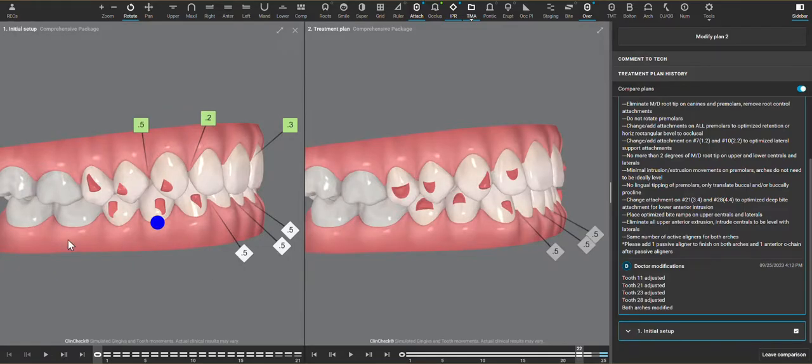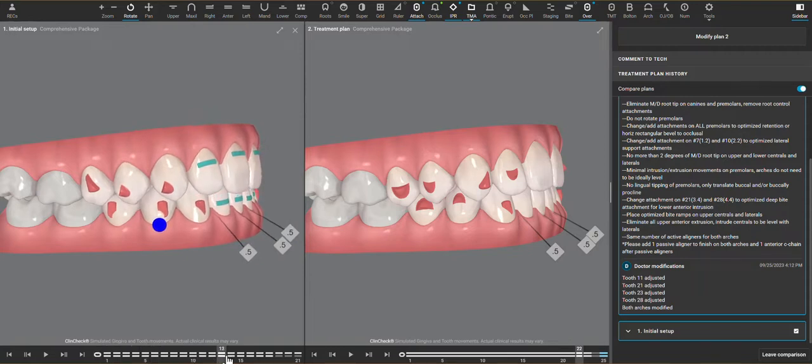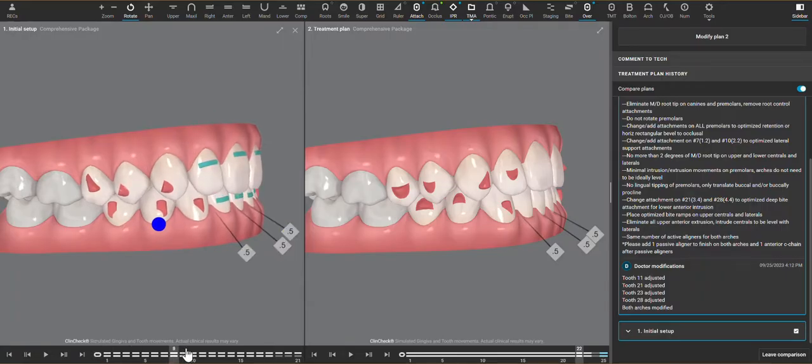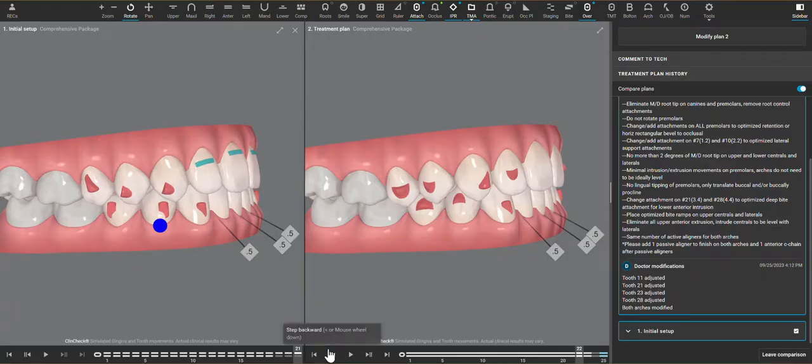Both of these cases have no molars moving, which is a great way to be because we need to hold the molars as our anchor teeth so that all the other movements that we do relative to them are going to be more predictable.